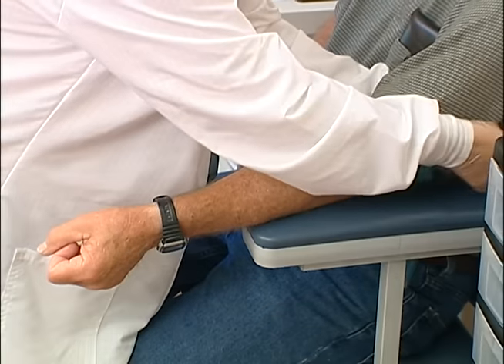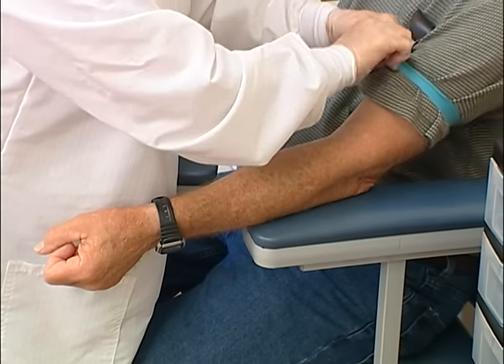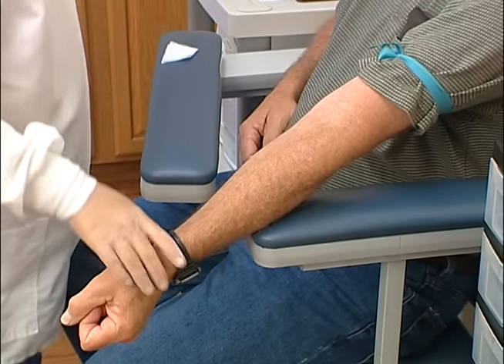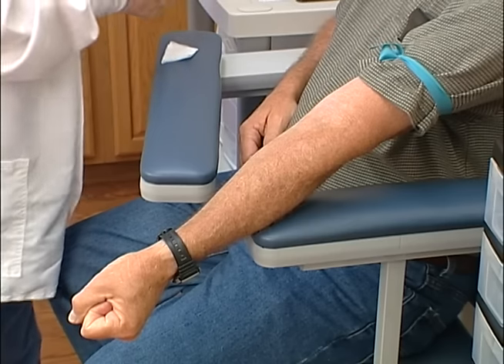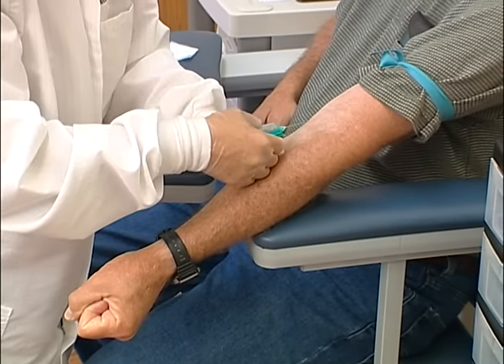Retighten the tourniquet and position the patient's arm in a downward angle if possible, so that the tubes fill from bottom to top, and remove the needle sheath. With the thumb of your free hand, pull downward from below the intended puncture site to anchor the vein and tighten the skin.